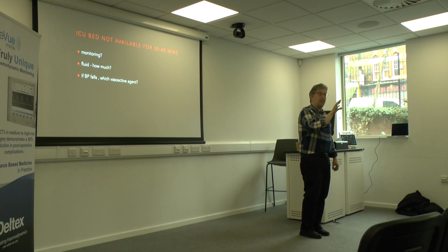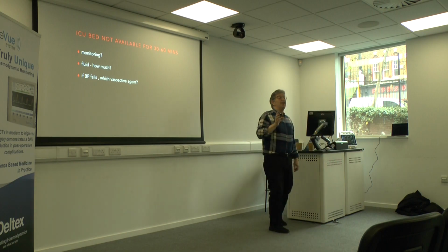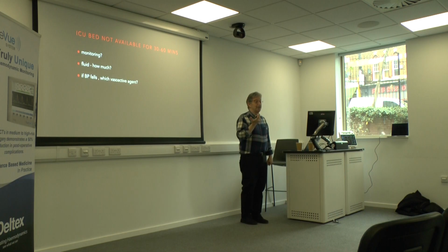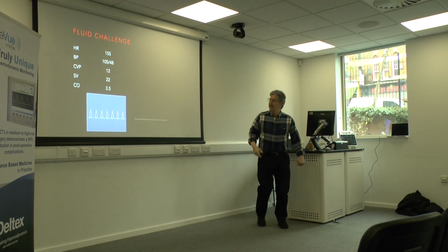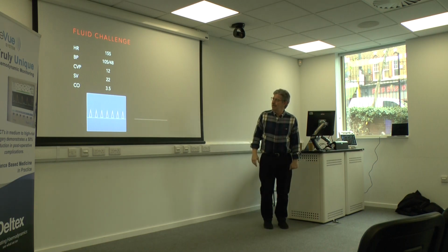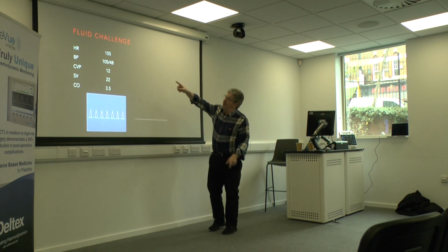You do. Thankfully with vaccination it's now much less common, but you've seen cases like that. You're nodding. Yeah, heard of it. So you do, and the reason is they had profound myocardial depression, in a young patient. And so I took a Doppler down, and I don't have a picture, unfortunately, but those were the numbers.